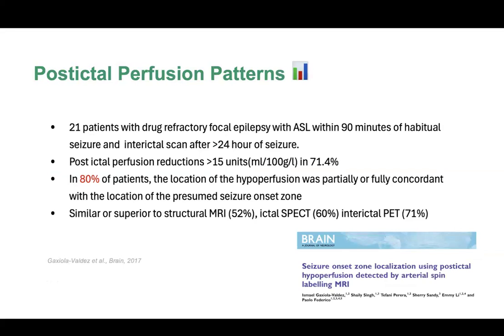It's called poor man's SPECT. Because when we want to see perfusion, the hypoperfusion will be seen in the interictal period. If your patients are in resource-poor settings where PET scan cannot be done, ASL perfusion can.